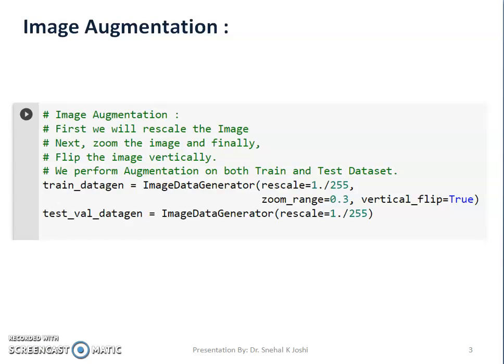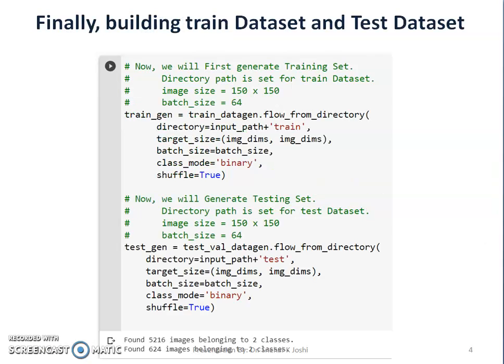As we know, the image is in grayscale, so each pixel has a value ranging from 0 to 255. This increases computational burden, so it's better to scale them to a range of 0 to 1 by dividing by 255. We provide zoom range as 0.3 and perform vertical flip. For the test dataset, we do not augment by flipping or zooming, we only rescale it. Now finally, we build the train and test datasets using parameters like image size and batch size.